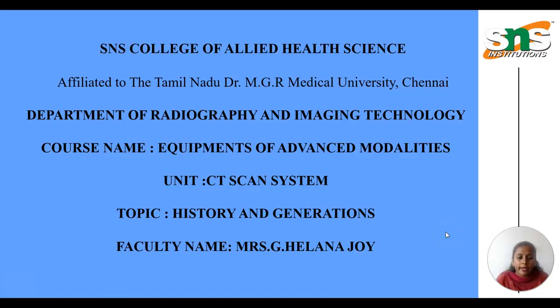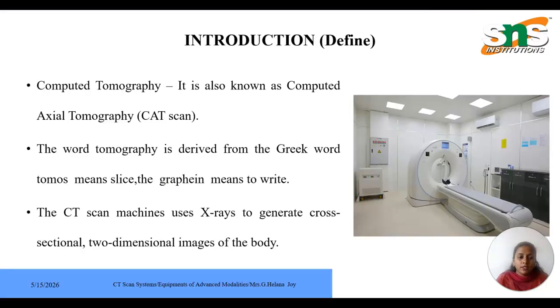Hello, hi all. In this video, we are going to discuss the CT scan system, its history and generations. CT stands for computed tomography, which is also known as computed axial tomography, and it is denoted as a CAT scan.